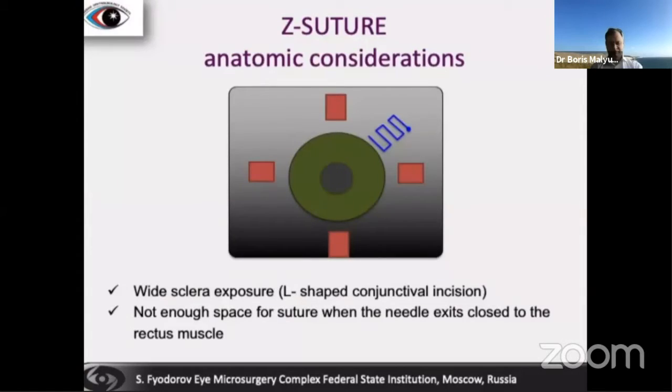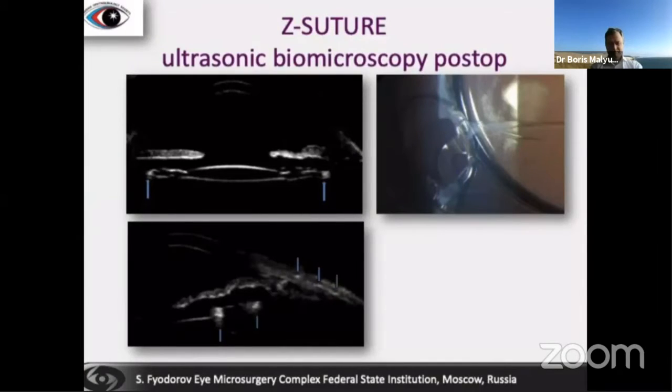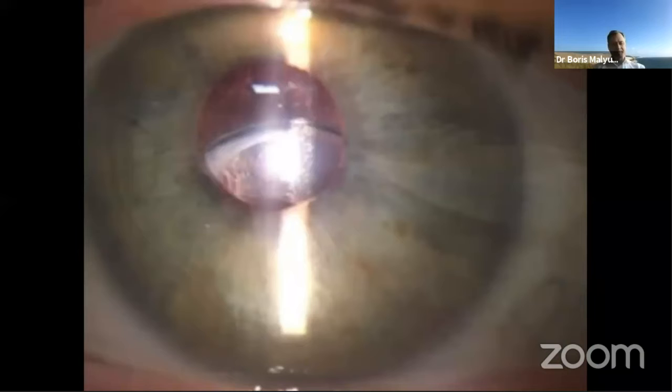Certain anatomical considerations should be kept in mind when utilizing the Z suture. First, relatively wide scleral exposure is needed. And second, there is not enough space for the suture when the needle exits close to the rectus muscle. Over the years, this technique showed us the stability of the implant and the reliability of the clinical results. You can see with the blue arrows the location of the CTR in the capsular bag and also the intrascleral path of the suture. We performed this technique with great success.